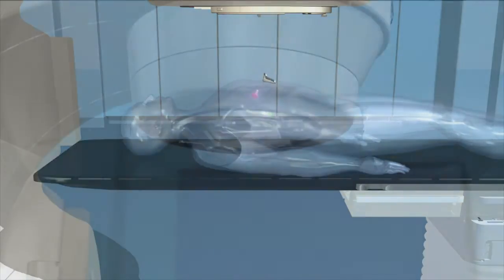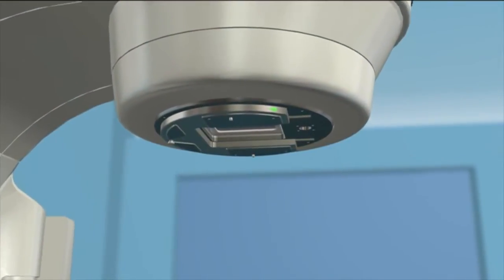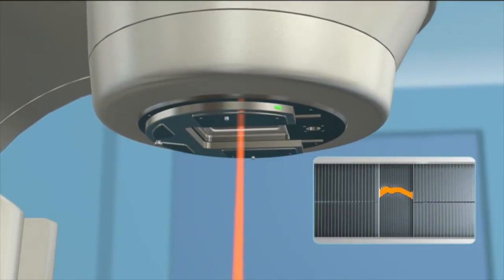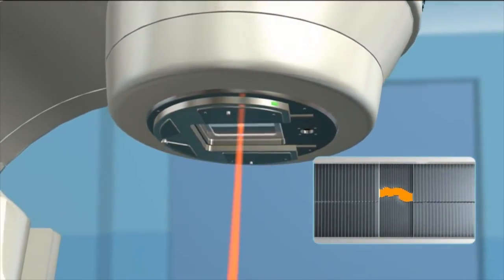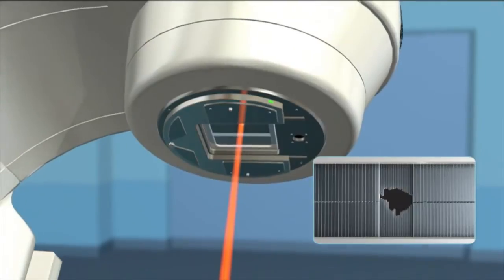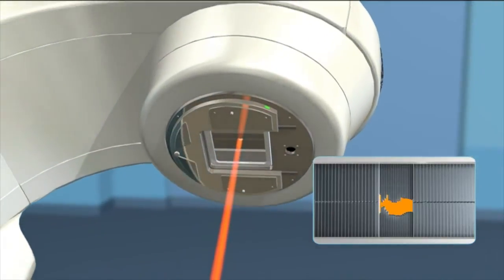The top of the machine, called a gantry, houses a multi-leaf collimator, which simply put, is a set of leaves that continually adjust to precisely match the shape of the treatment beam to the shape of the tumor from every angle.